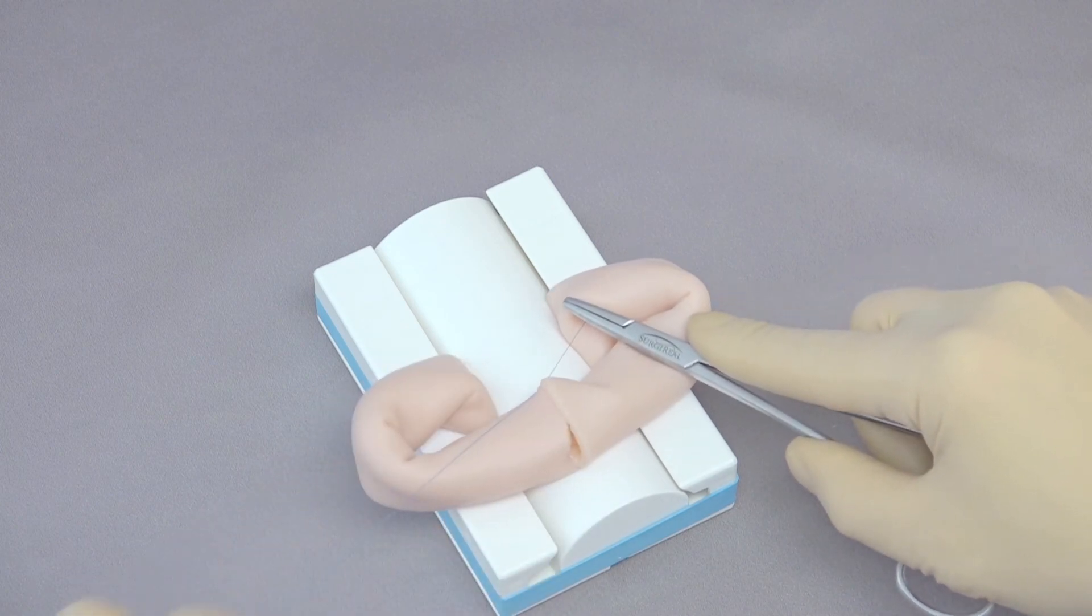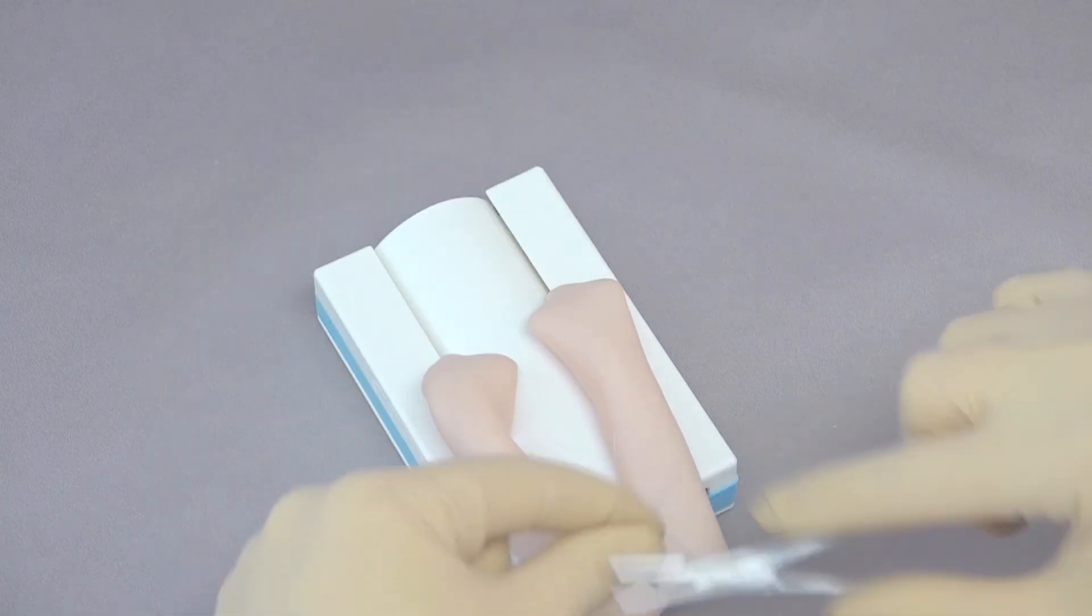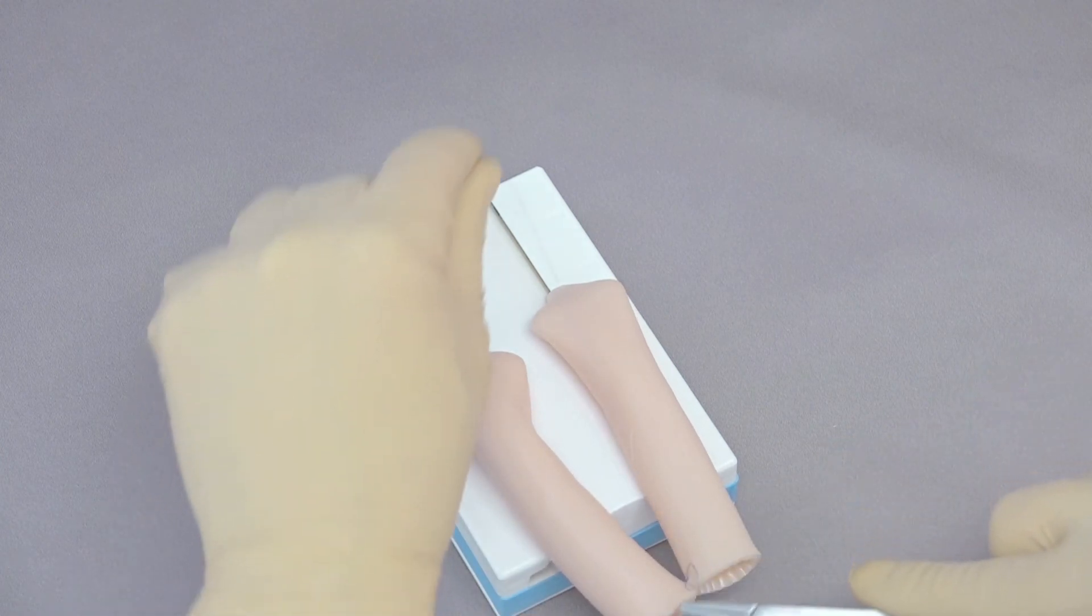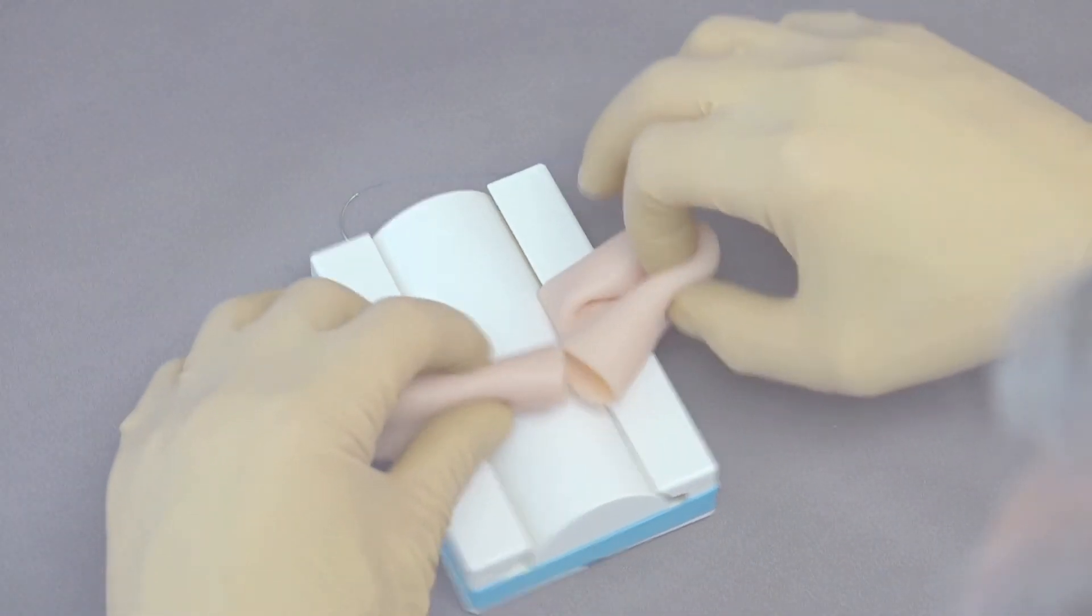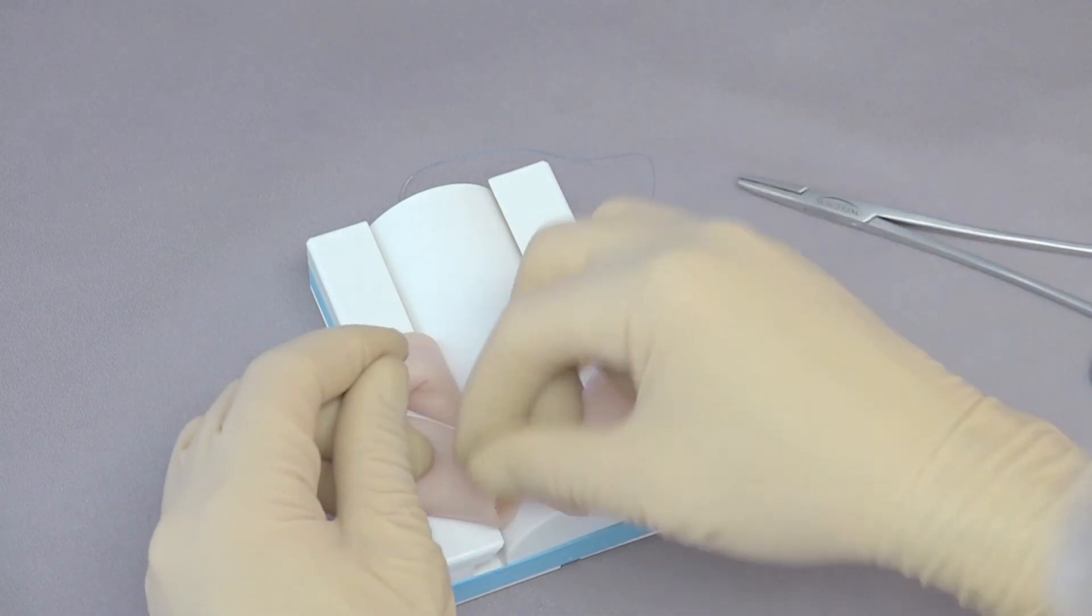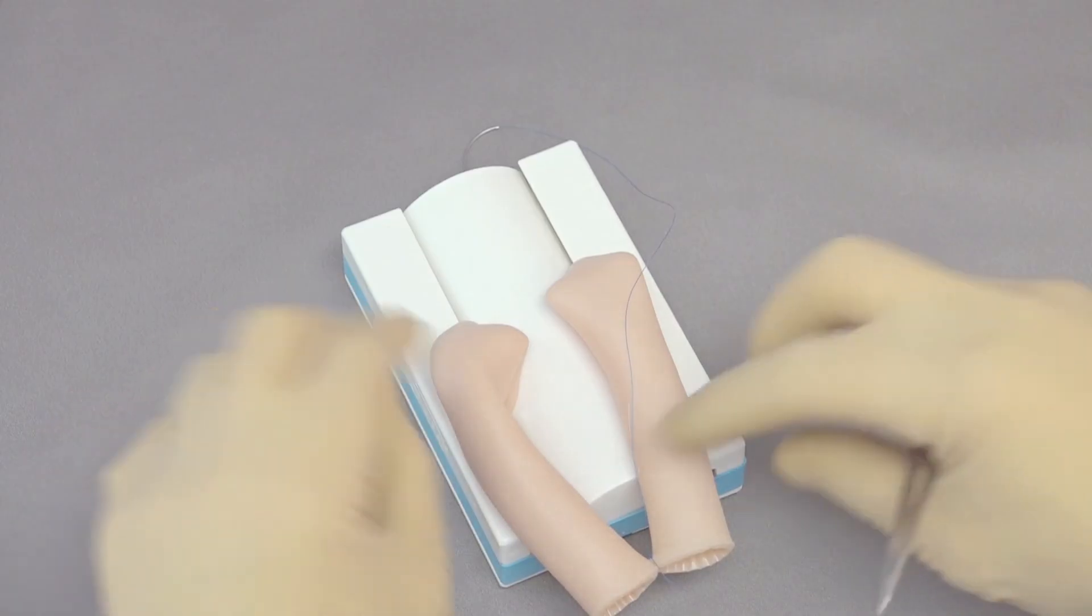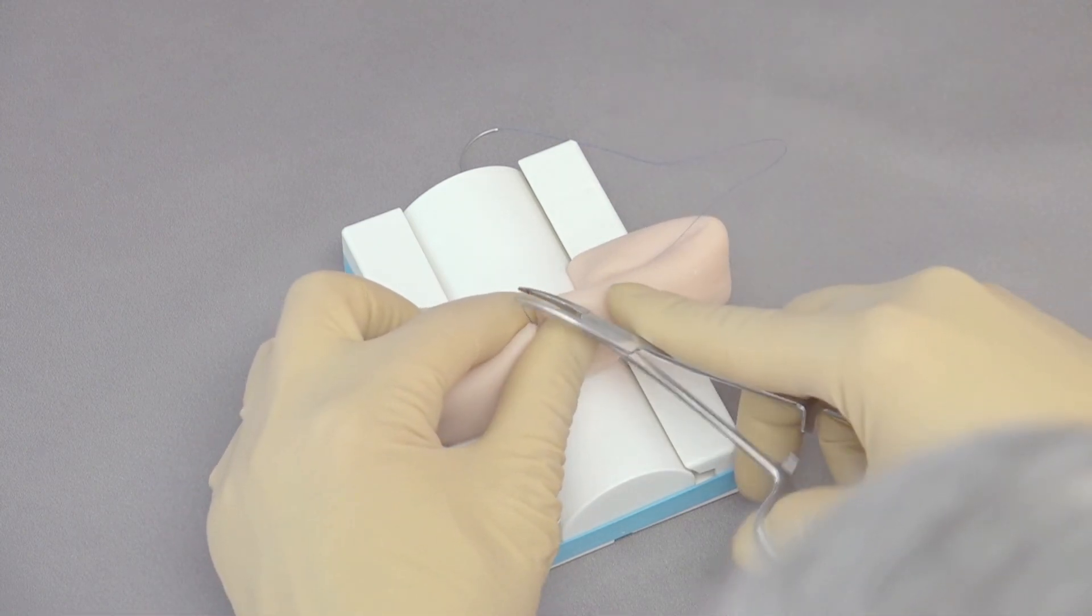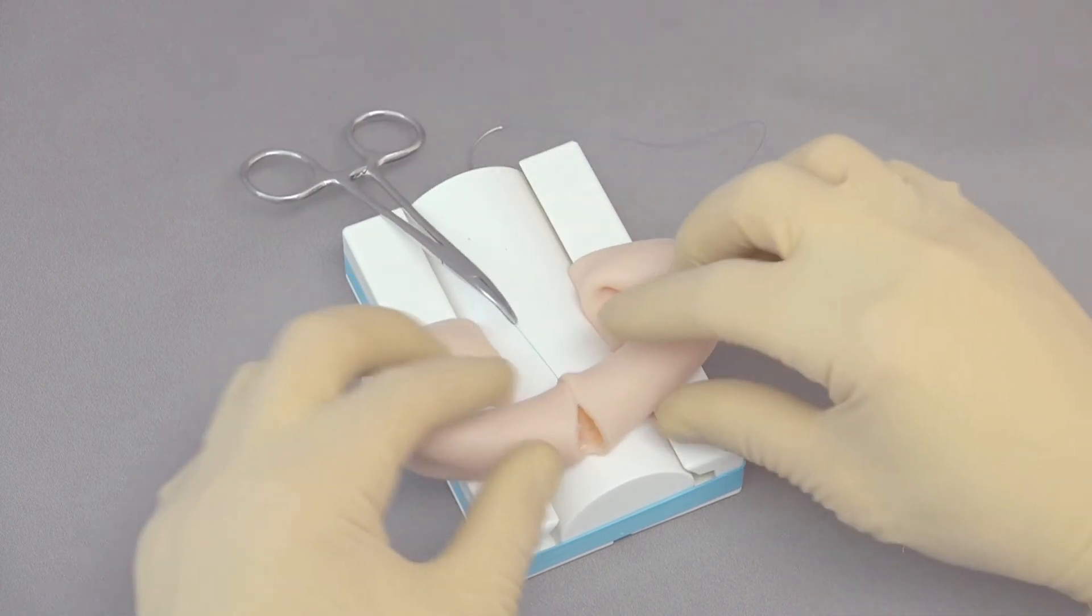Pull that suture through and then I can tie this one. Again just manipulate so they're facing each other. I can tie a fourth throw square knot. I can leave the needle on that one. Again reposition the bow. I want to cut, I can either cut this end or I can actually use a hemostat for a stay suture. We can take this short end and attach it to a hemostat and push it to the side so that will help to stabilize.